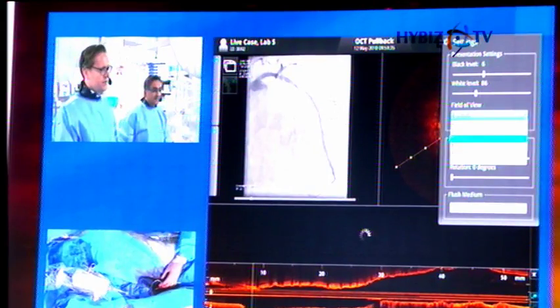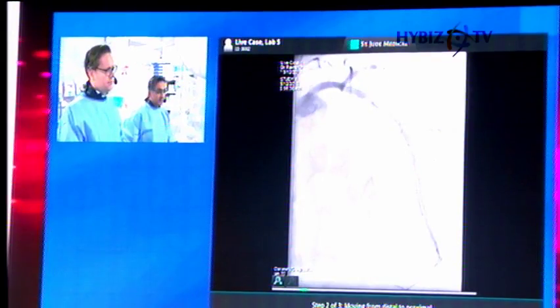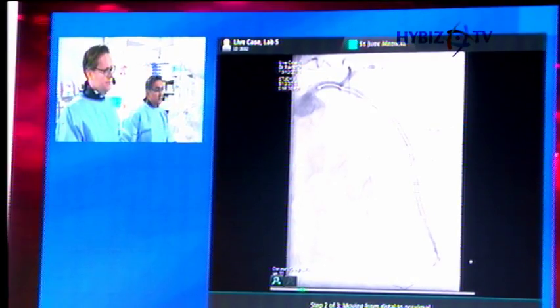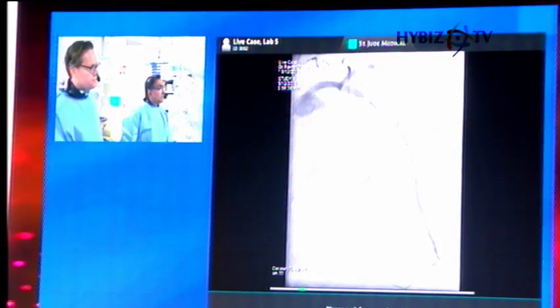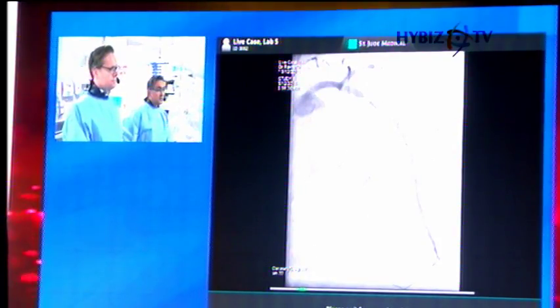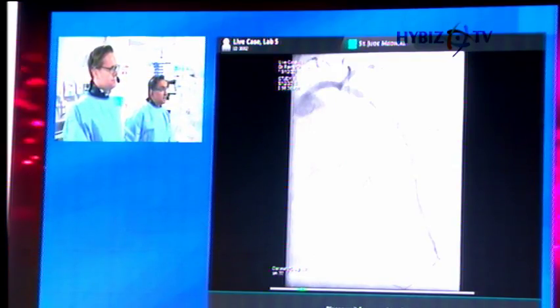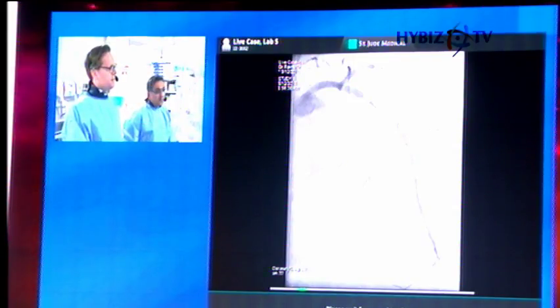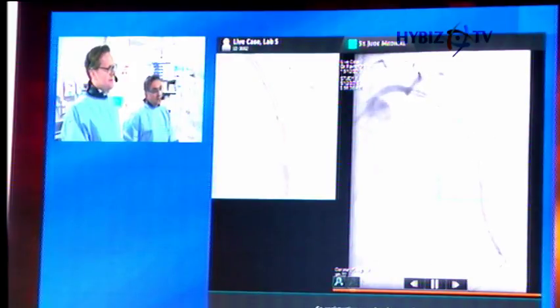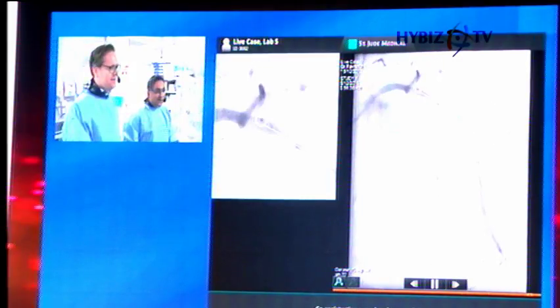It's interesting. We were just discussing this, and we have the system as well, and some of our operators have gone away from using it because if you don't do it just by scrolling with that image on the left, you can localize the lesion in various points of the artery. So some of our operators use it, some just do it that way because they have to wait for these 5 seconds. Yeah. Not good for an interventional cardiologist. The 5 seconds is far too much. Exactly.